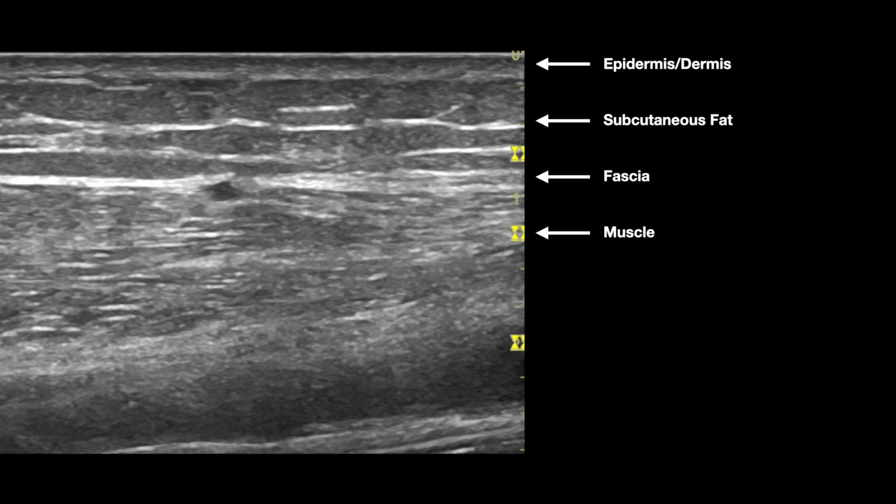At the very near field, you can see a thin layer with a dense echo texture. That's going to be the epidermis and the dermis. Then we go down a layer, and you can see that looser, more marbled appearance of tissue. That's going to be the subcutaneous fatty layer. Deep to that is that hyperechoic bright white line, which is our fascia. And then deep to that is the very coarsely striated layer, our muscle layer, essentially. If we stare at this for a little bit, it's going to help us identify these as we go to our patients.